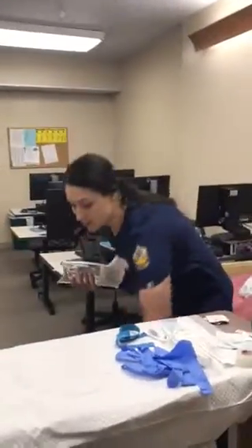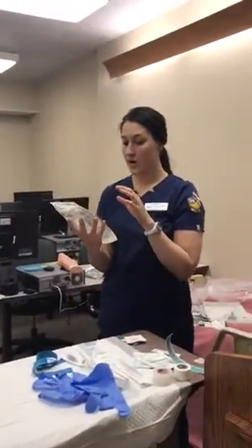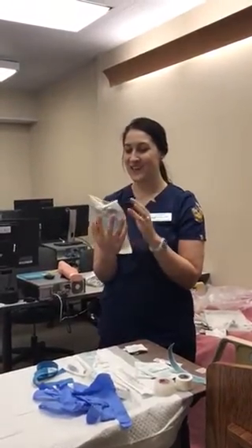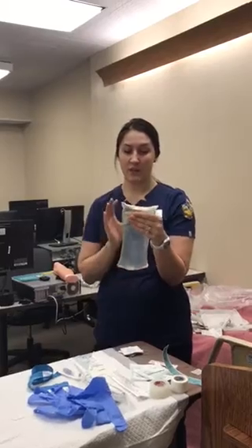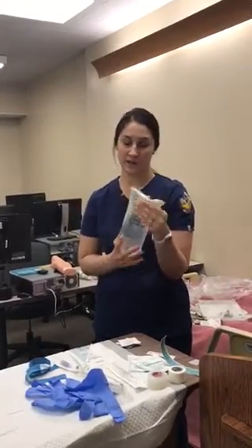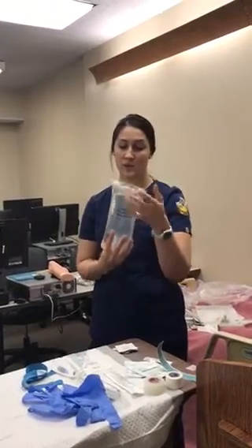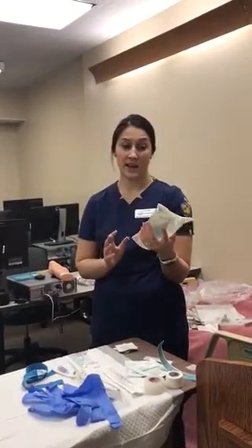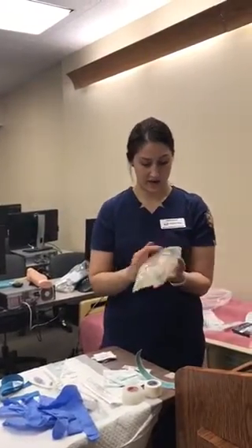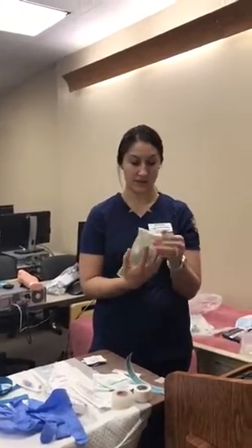So the next thing I'm going to do is check my bag for any particulates, discoloration, and then expiration. This bag is expired January of 18. For this video, we are going to use it. However, if this was a real life situation, I would toss this and get a bag that was not expired and that did not have a little bit of this yellow color that this bag does have.